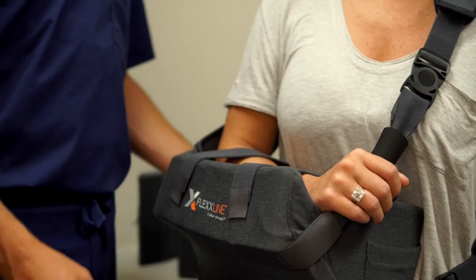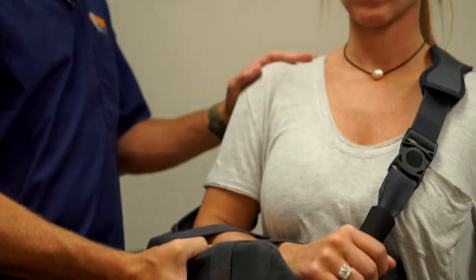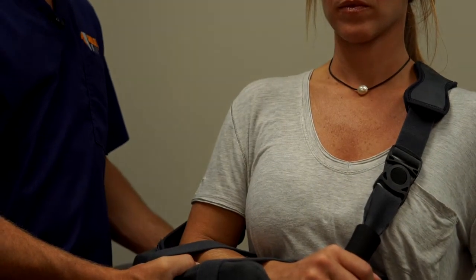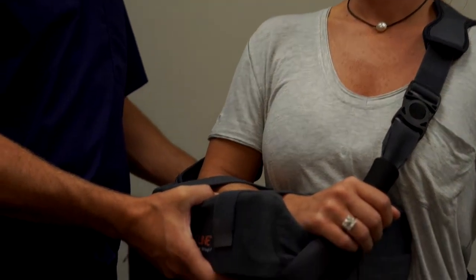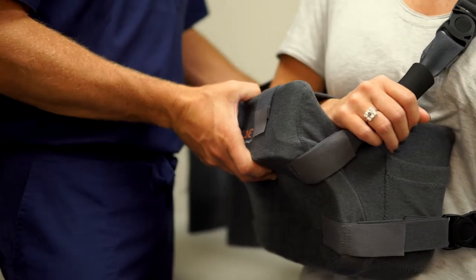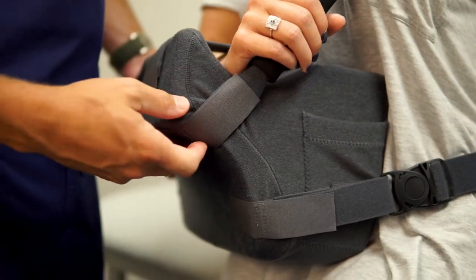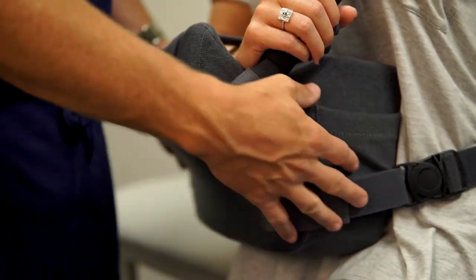By adjusting the tension on the shoulder strap, you can adjust the height as well, and then the shoulder can relax and sit more comfortably. It's also very common to have patients with a certain position — whether it's a little bit more to the front or a little bit more to the side — where they're more comfortable. These straps are all adjustable both in location and length.